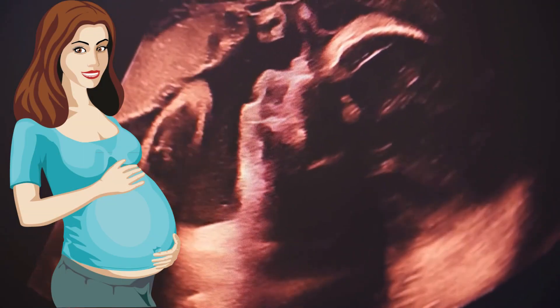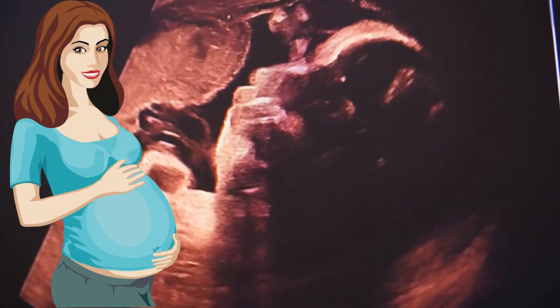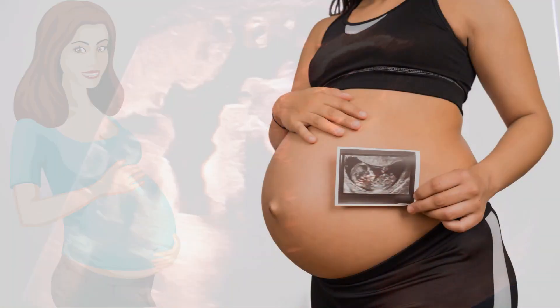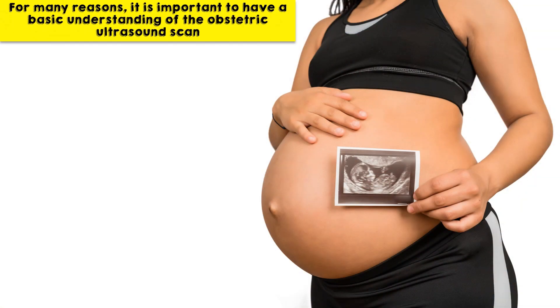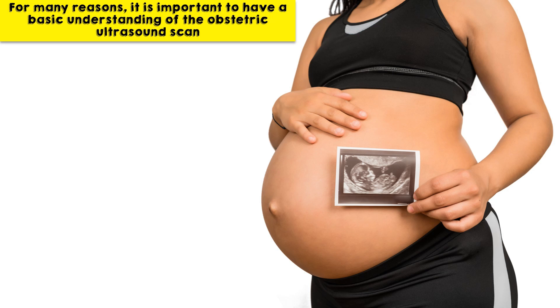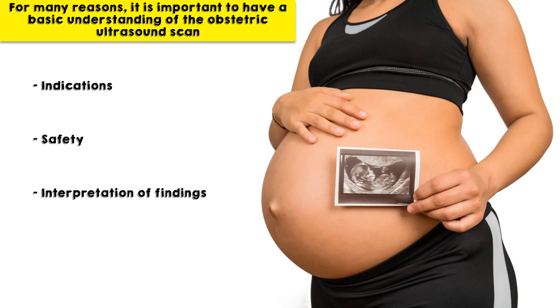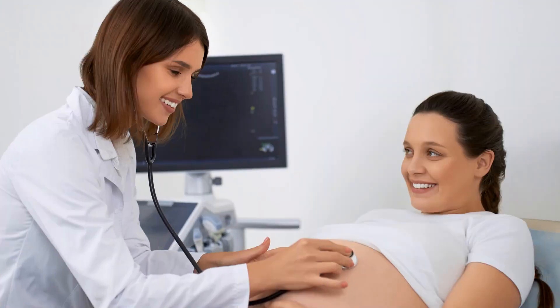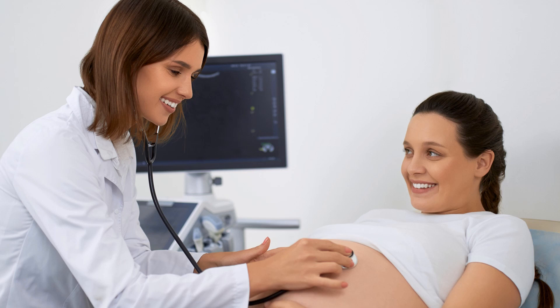Obstetric ultrasonography, or ultrasound during pregnancy, is a routine procedure in radiology. For many reasons, it is important to have a basic understanding of the obstetric ultrasound scanning, including its indications, safety, and interpretation of imaging findings. In this video, you are going to learn about those aspects in detail.